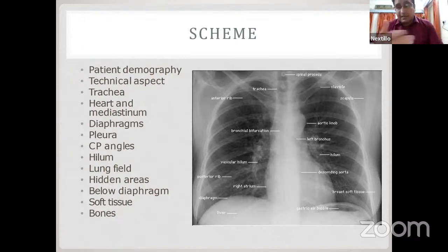Okay, comment if you are able to understand, please, because I'm also new at this. Kindly comment if you are able to get this radiology thing. I know radiology is a bit boring, a black and white subject, but it's fine. So first we are going to look for the cutaneous, subcutaneous tissue, breast tissue, soft tissue. Then kindly comment, I'm looking at your comments. I will get to know that you guys are able to understand something.